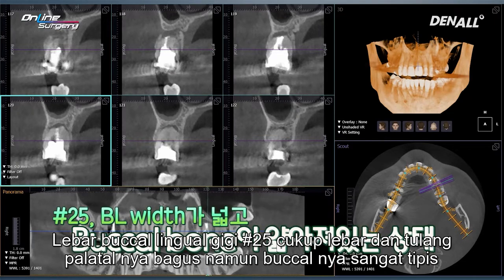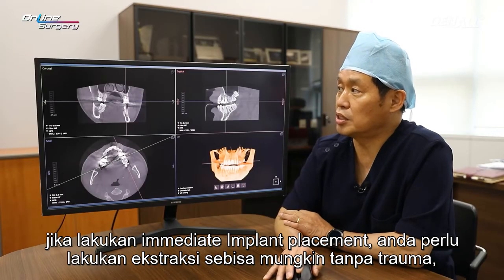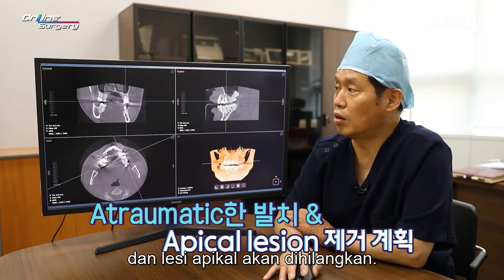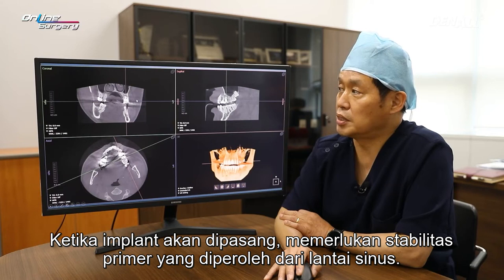The buccolingual width of number 25 is quite wide, and palatal bone is favorable, and buccal bone is very thin. If you take a look at the CT, sinus cavity itself is without problem. With immediate implant placement, you need to do extraction as atraumatically as possible, and apical lesion is going to be removed. When implant is going to be placed, the primary stability is going to be gained from the sinus floor.